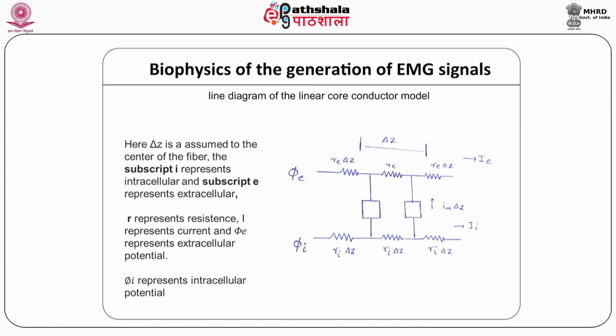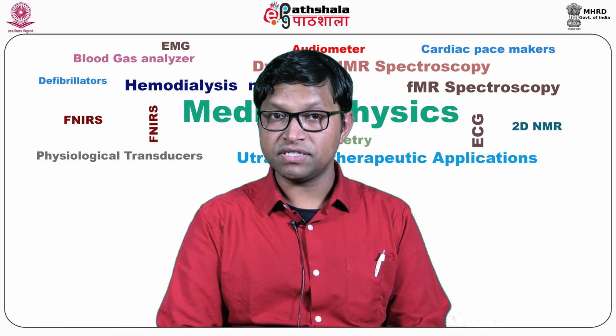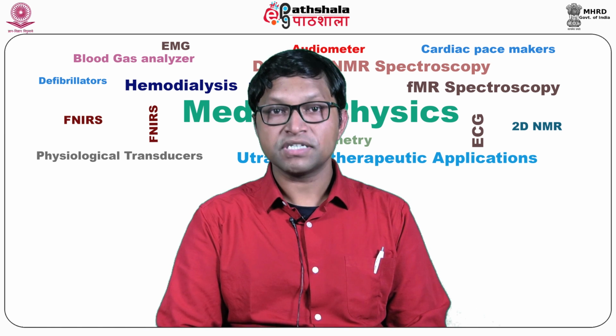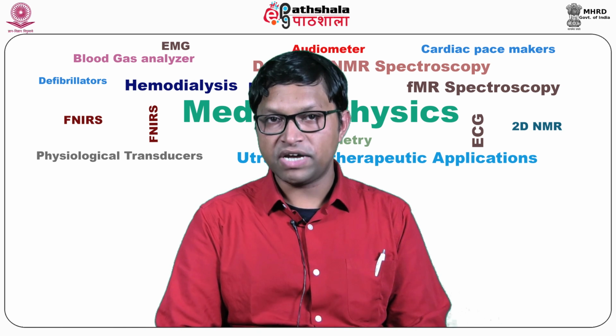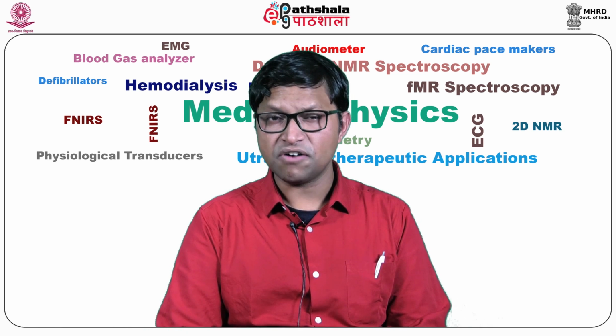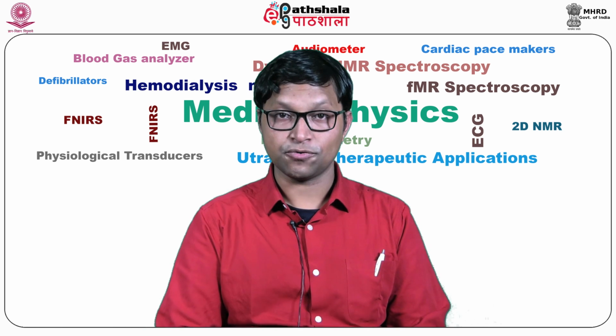the tendon endings. We know that a current flow is also associated with potential changes. This propagating action potential creates a transmembrane current profile that also travels along the membrane of the muscle, or sarcolemma. For the muscle fibers, the length of the depolarization and repolarization are very small, on the order of millimeters. So, we can consider a muscle fiber a very thin tube in which the current flows only axially. In other words, it can be considered as a line source model.